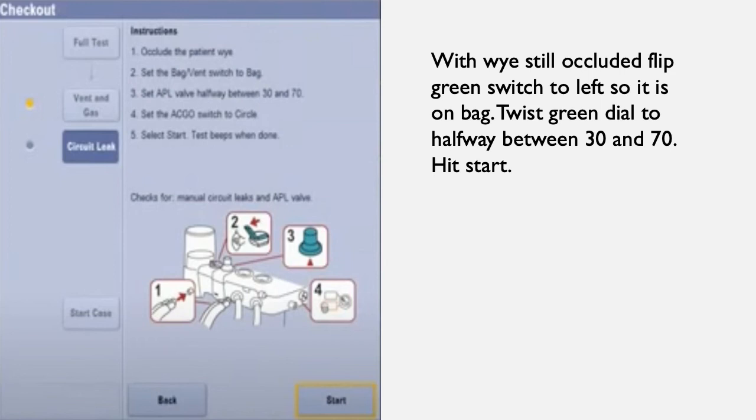Next, you will flip the green switch to the left and turn the green APL dial halfway between 30 and 70. Then select start. This will count down from about 1 minute.